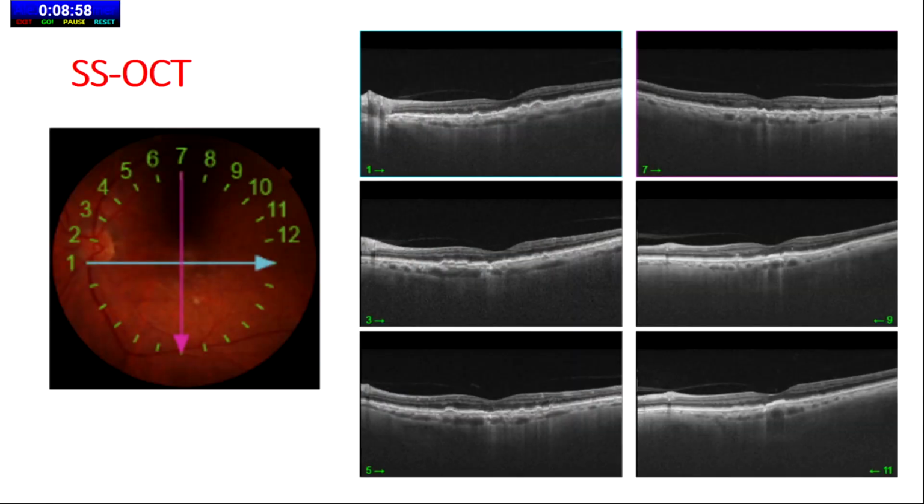That is the OCT which is passing all through, and I said that's an artifact because that was pseudo color, but you can see in all the scans a flat, irregular, fibrovascular PED, whatever you want to call it, but there is no evidence of any intraretinal, subretinal, or sub-RPE fluid, and there is no evidence of any SHRM either. So as far as current understanding and accepted treatment and kind of brackets of labeling patients are concerned, this patient is non-exudative.